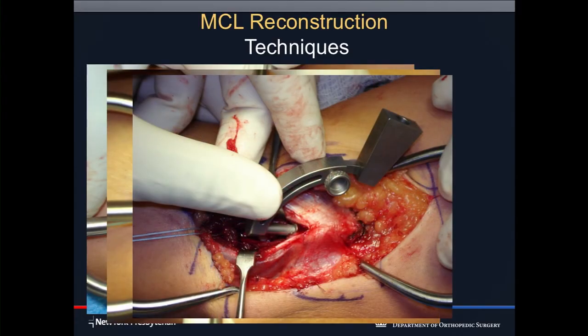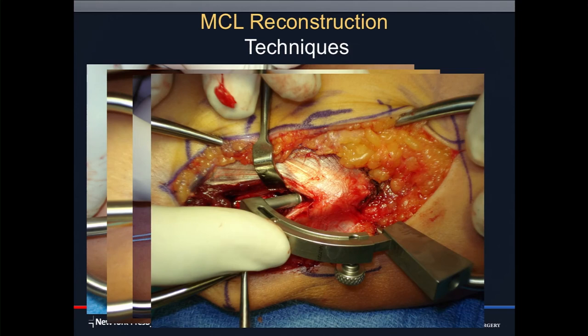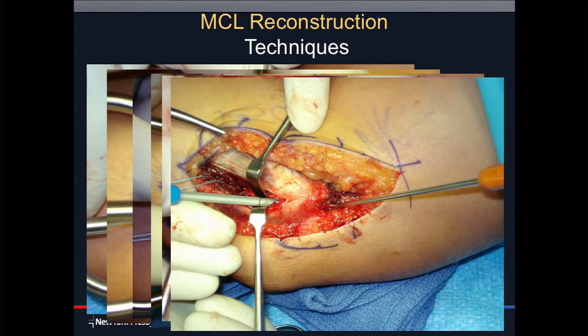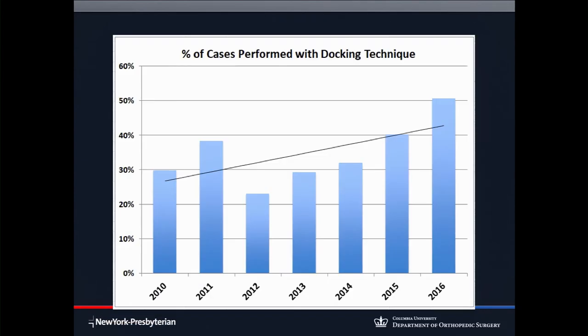And then here's a clever jig. It's in the back room during the break. You can visit and look at it so that you can get those connecting tunnels for either weaving the graft around or doing your docking technique, and be perfect with the tunnel length. And then you could even have these instruments available in a kit to help you pass.